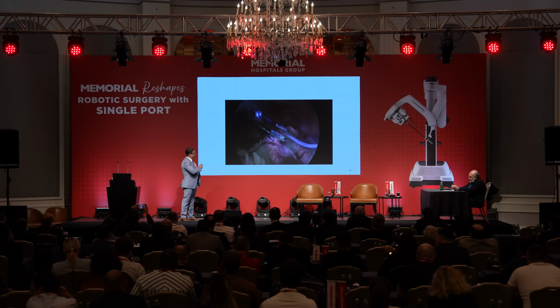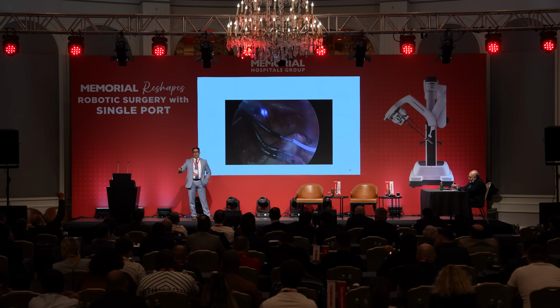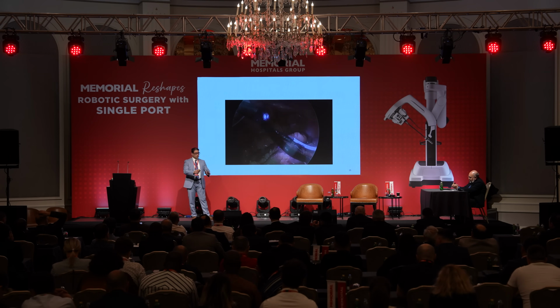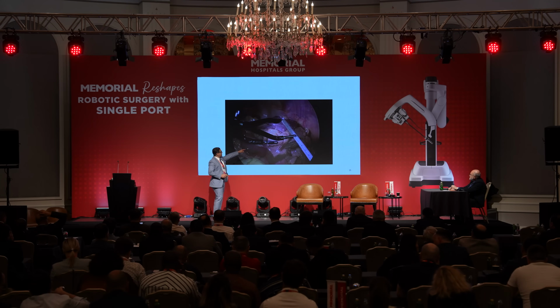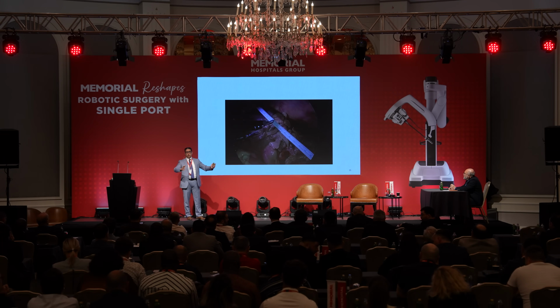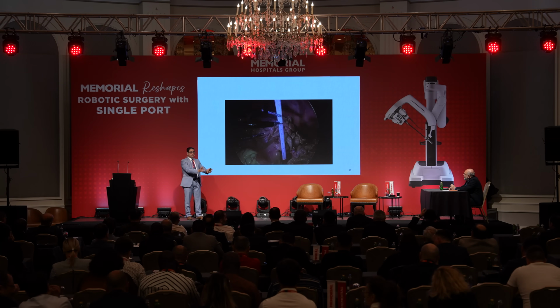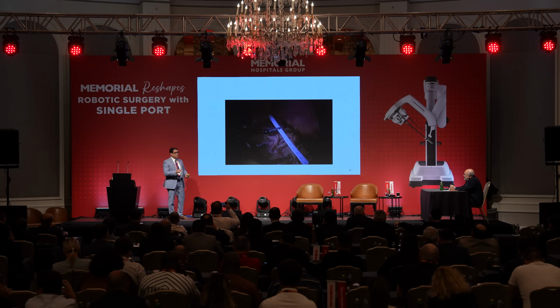Now, I put this ruler there to show two things: the span of the arm movement, and each arm in relation to the neighbor, to the next arm, how you can move. This is the middle arm, this is arm 3, and this is arm 1. And you can see, if you have an arm between 1 and 3, you can overlap. Two arms next to each other, 1 and 2, and 2 and 3 cannot overlap. However, going up and down, that should be okay with all the arms together.